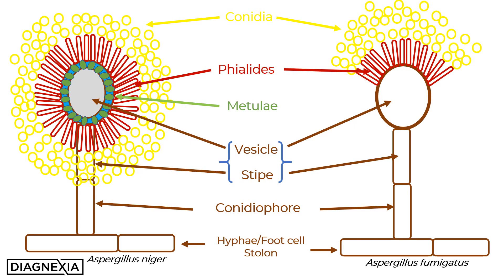Aspergillus niger is called a biseriate fungus because it has two layers, as opposed to Aspergillus fumigatus, which is a uniseriate fungus with one layer. The additional layer seen in Aspergillus niger is a metulae layer. Taking it in order: the most peripheral forms are the conidia, produced at the ends of finger-like projections called phylides, which arise from the metulae. Within the center is a vesicle, born by a hyphal form called a stipe. Collectively, the vesicle bearing the metulae, phylides, and conidia, together with the stipe, form the conidiophore.